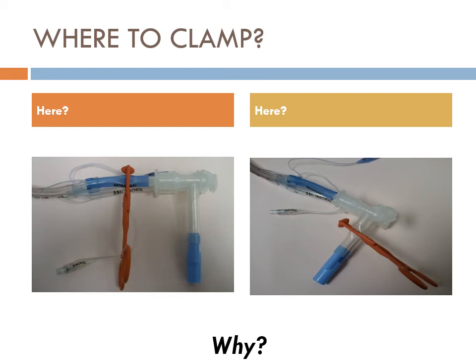What am I ventilating now? Tracheal port's clamped. Just the left. Do I still have air inside the right side lung? How do I get the air out? How do I deflate the right lung? I'm ventilating the left. How do I get the air out of the right? Gotta take the little valve or this little plug off. Now I'm still only ventilating the left, but now air can come from the right side through that tracheal port and out to this open air port to atmosphere.